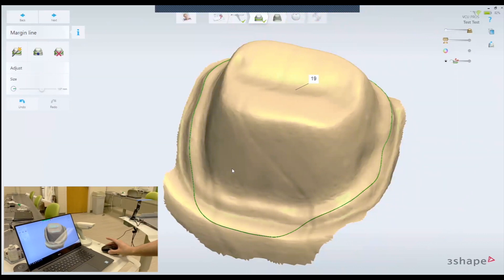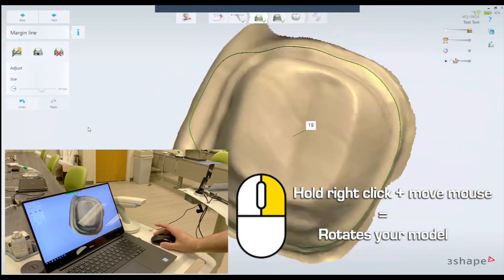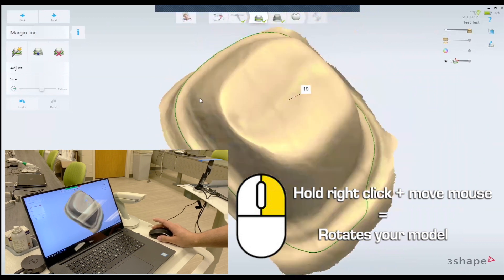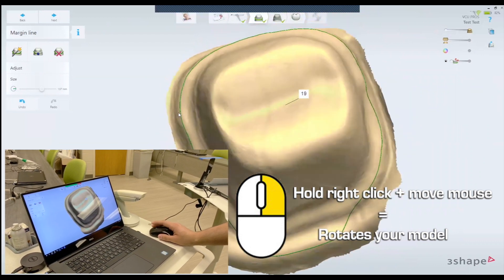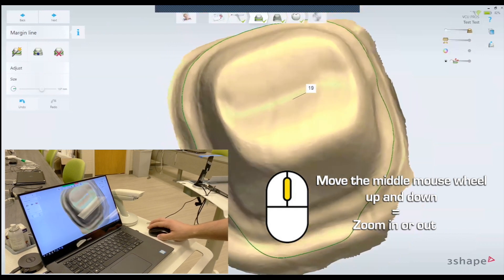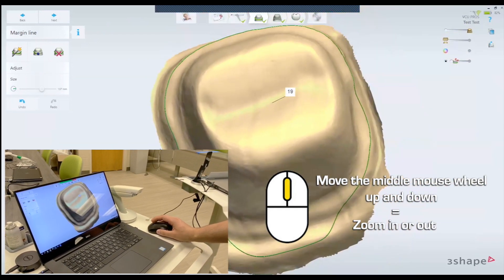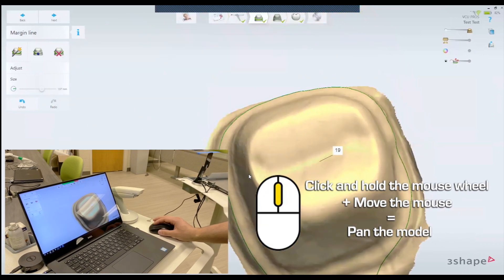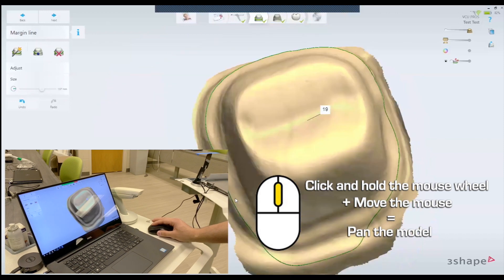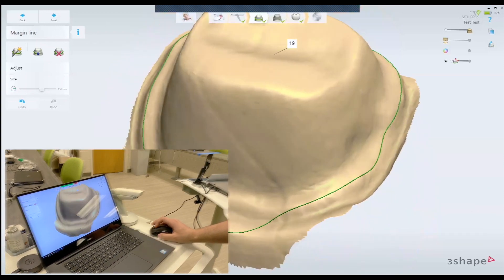I have a three-button mouse. With the mouse, click and hold the right-click — it rotates the model. The right-click and the mouse will rotate the model. If you want to zoom in and out, you will use the middle mouse scroll button. If you want to pan the model, you're going to click the middle mouse button and pan it around. That's how I usually control the view of my model.